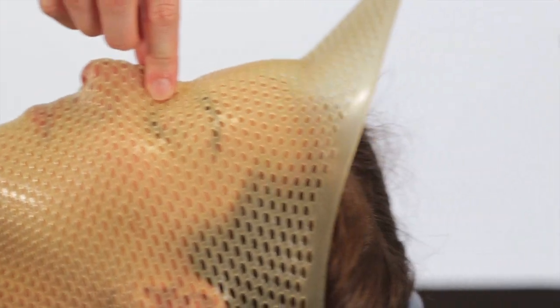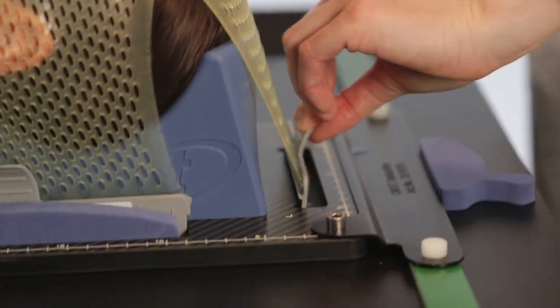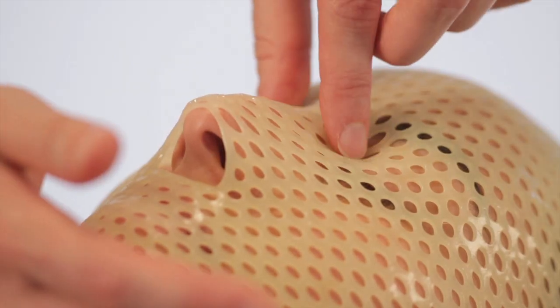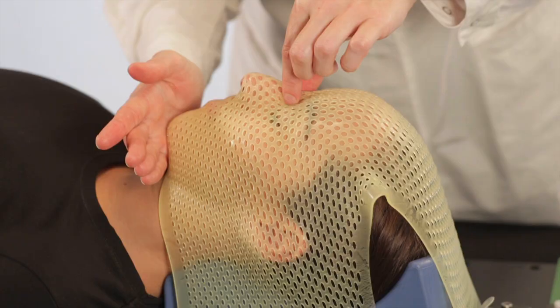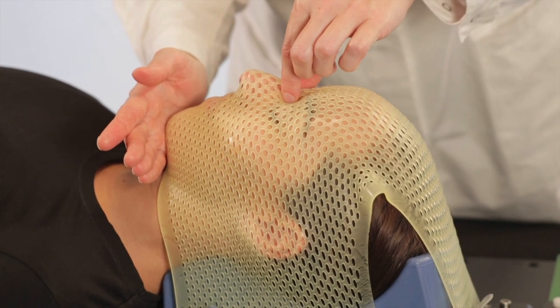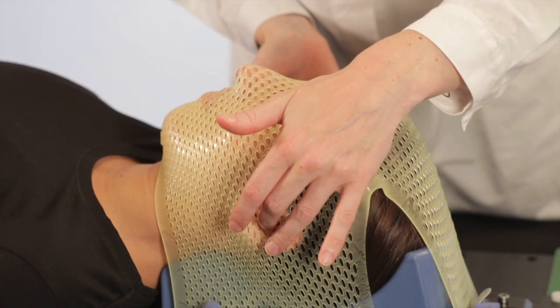Hold the material at the nose bridge and stretch the cranial flap. Mold over the chin and over the bony part of the nose. Push the material slightly into both ears to serve as reference points for the patient.